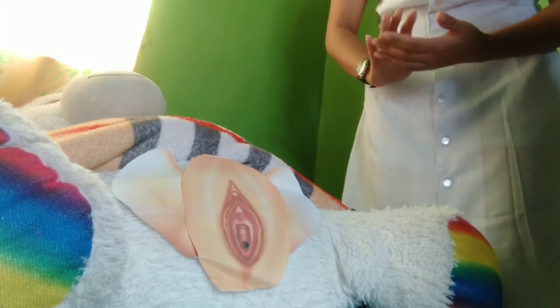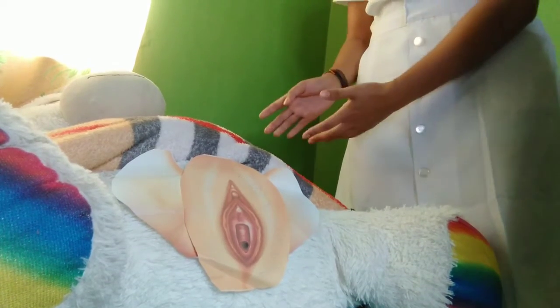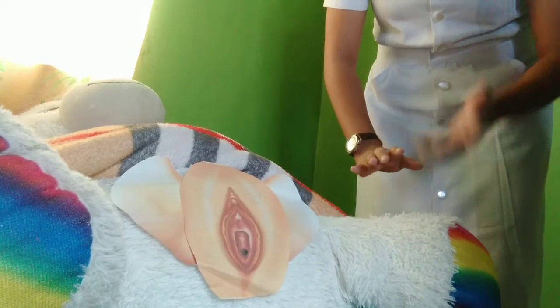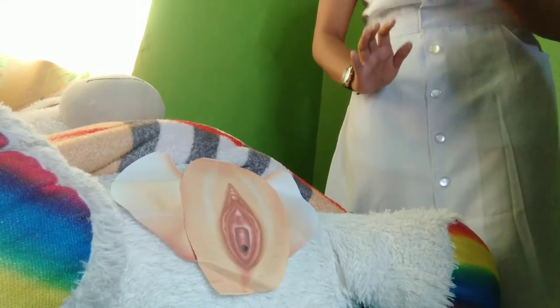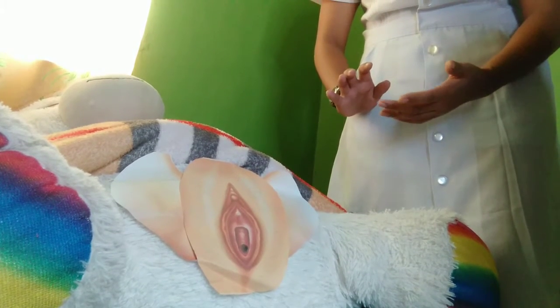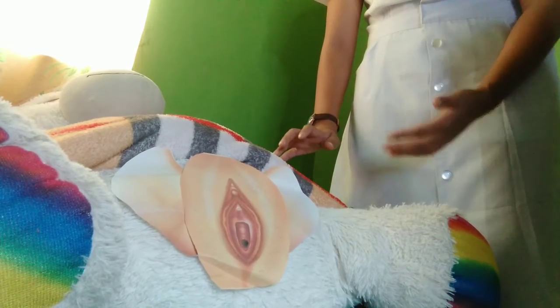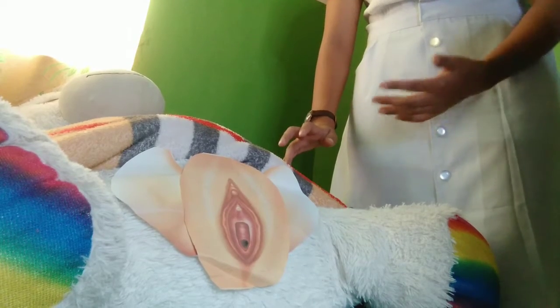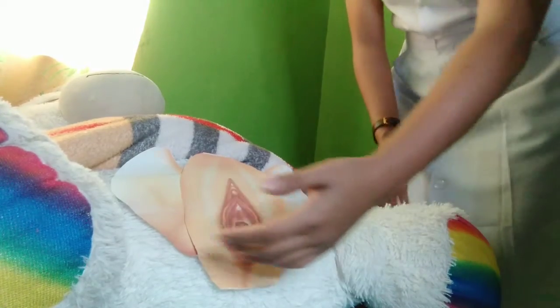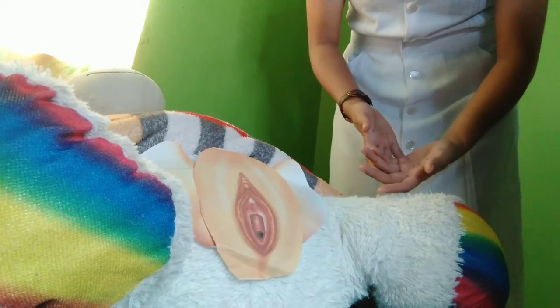So step 7 is the positioning of the patient, which depends on gender. My patient is a female patient. So, on her back with knees flexed and thighs relaxed so that the hips rotate to expose the perineal area. Alternatively, if the patient cannot abduct the leg at the hip, the patient can be side lying with the upper leg flexed at the knee and hip supported by pillows. The patient should be comfortable, with the perineum exposed for ease and safety in completing the procedure.